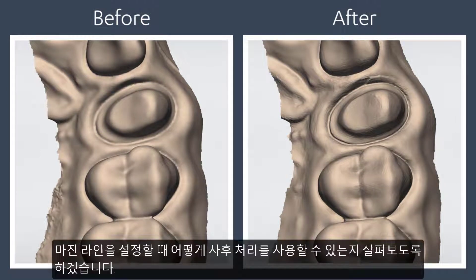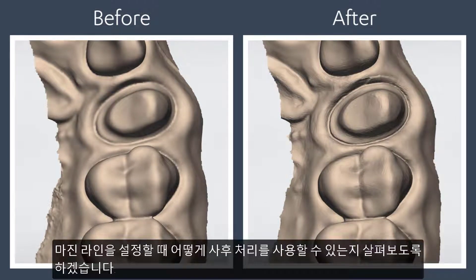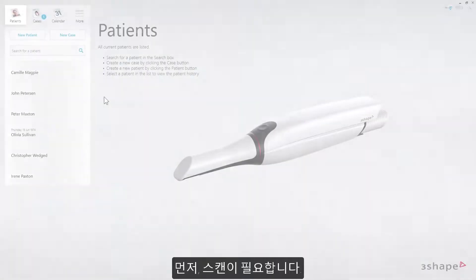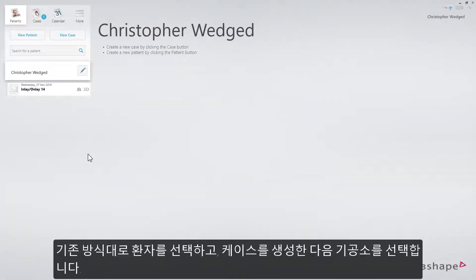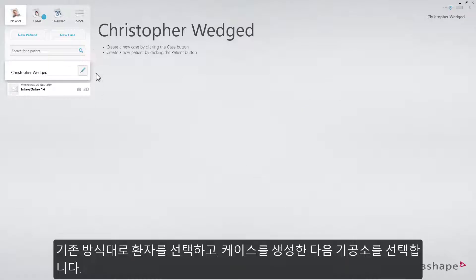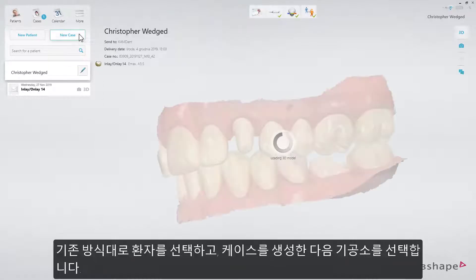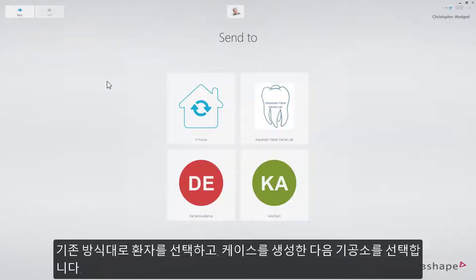Let's illustrate how you may actively use this post-processing when setting the margin line. First, we need a scan. Select a patient, create a case, and select a lab in the usual manner.